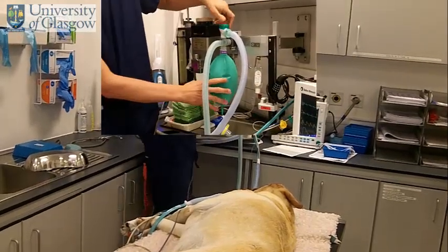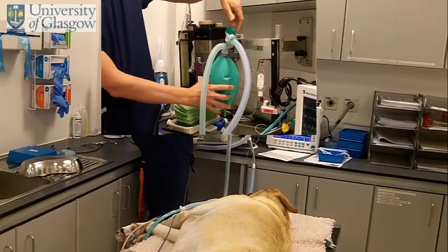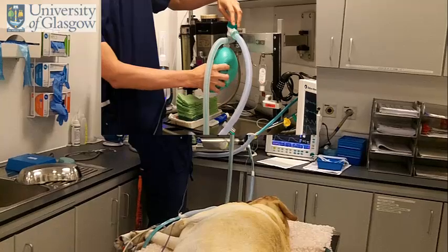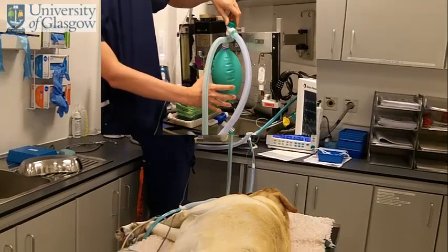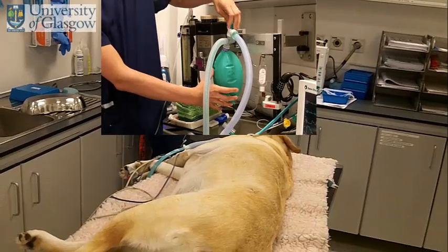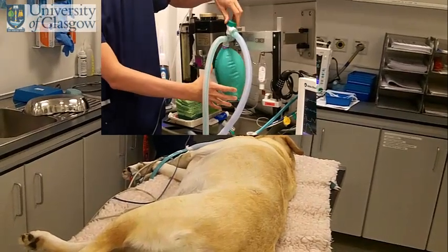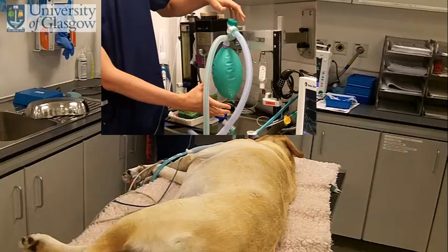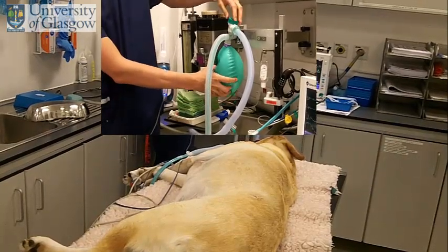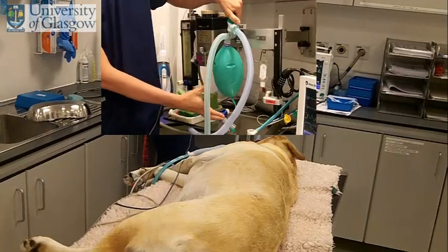What we're doing to ventilate the patient is we close the APL valve on the Bain system, somewhere between 75 and 100 percent. We squeeze the bag, watching the patient, and then open the valve again. We're doing that maybe every three or four seconds to give a rate of about 10 or 15 breaths a minute. Close the valve, squeeze the bag, watching your patient, then open the valve again.